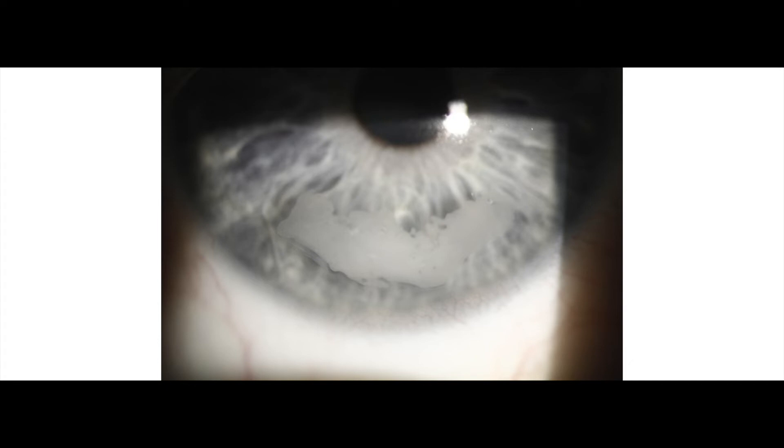You can see here, this is after one treatment. It's three months after the initial treatment. Of course, it's just painless for the patient.